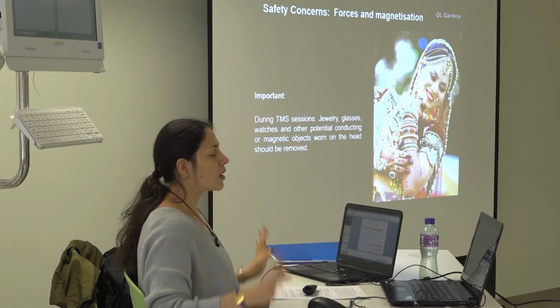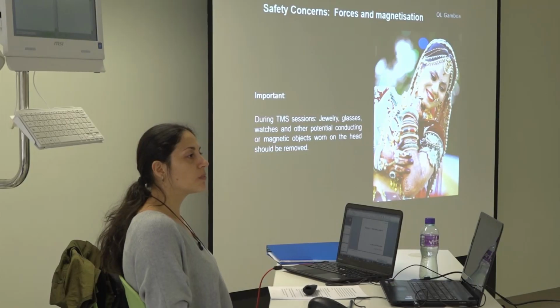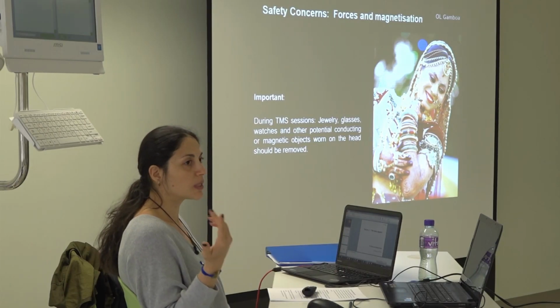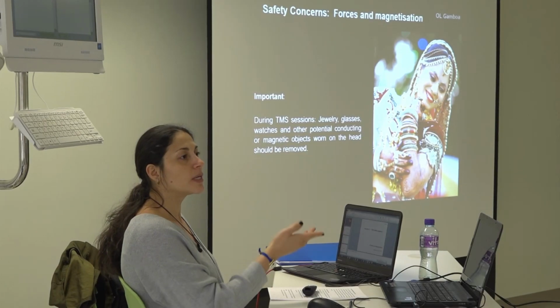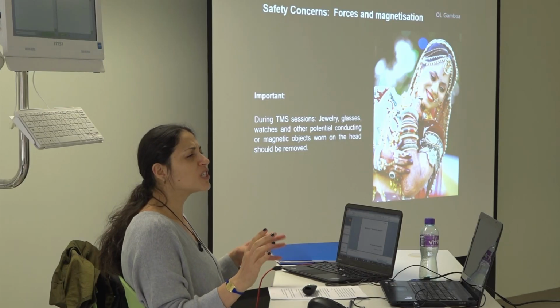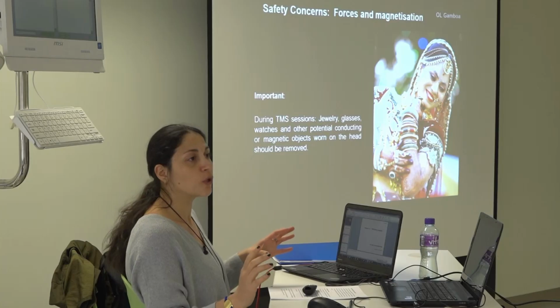I was talking to the company we're working with for the machines some days ago because of one of these issues. I didn't want to measure someone with piercings. I have never done it, but I wanted to know what the regulations were. And he said everything that is within 30 centimeters of the point of stimulation should be out of the question. You don't measure that. Not because you say, yeah, but it's far and maybe it will not happen. No, don't do it.